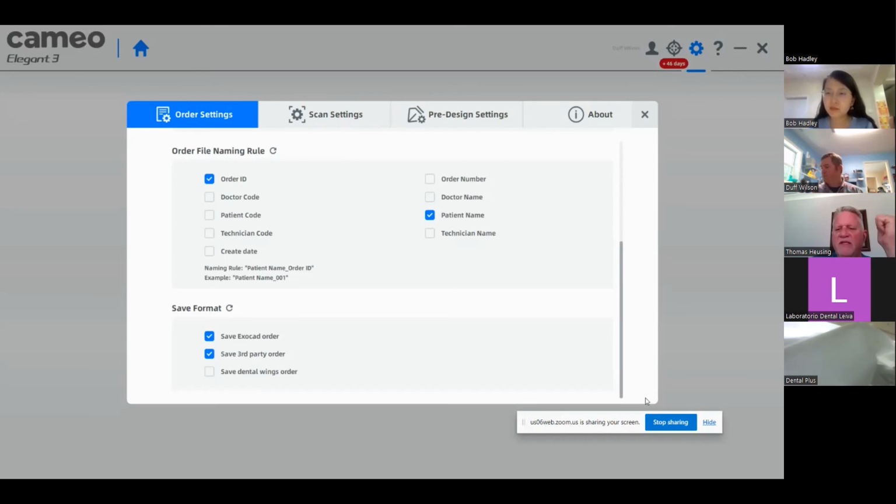Okay, very well. That makes sense. Also, you said that the tips can get autoclaved 200 times before replacing. 100.